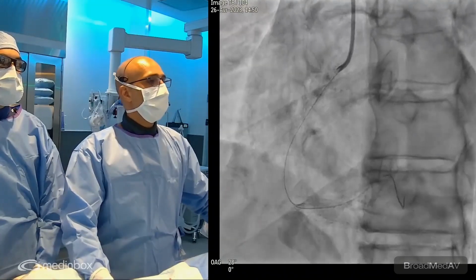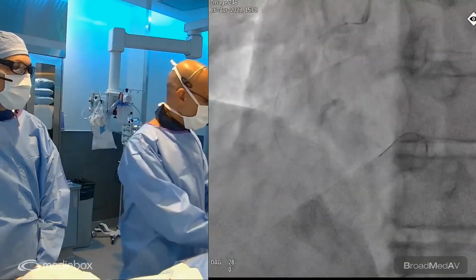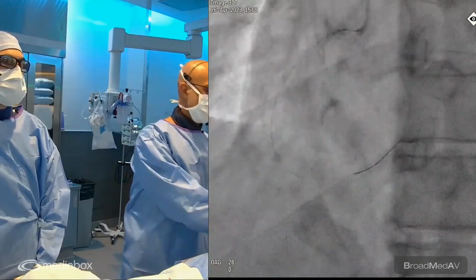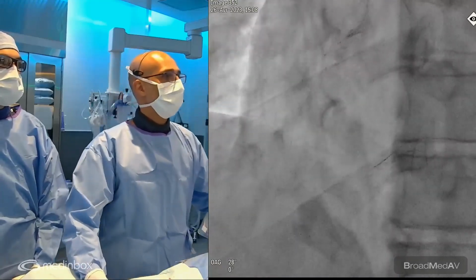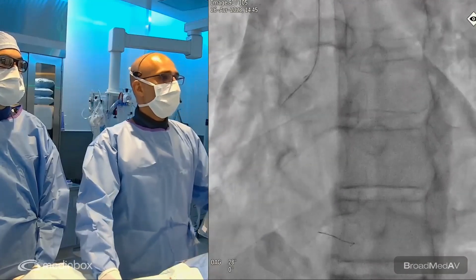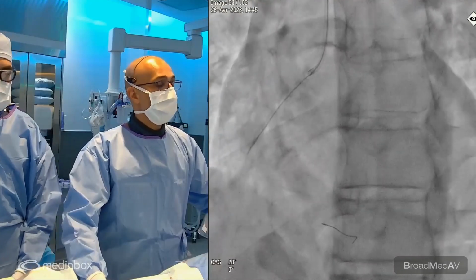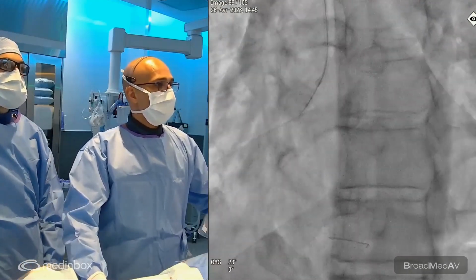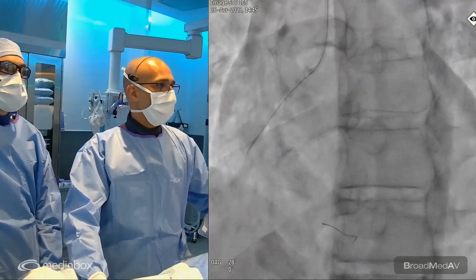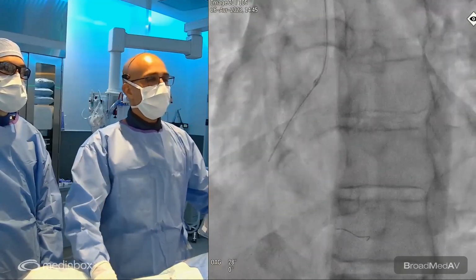Next, I would have liked evidently to do imaging before atherectomy, but since the lesion was subtotal, I decided to go on atherectomy first. Can I see the atherectomy, please? So as you know, the orbital atherectomy, it's a 1.25 millimeter burr, and the sanding occurs antegradely and retrogradely, and the burr is mounted eccentrically. So you get more touch of that deep calcium. So it went easily through.